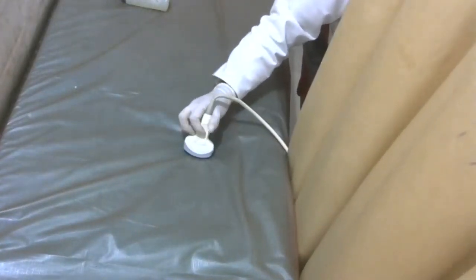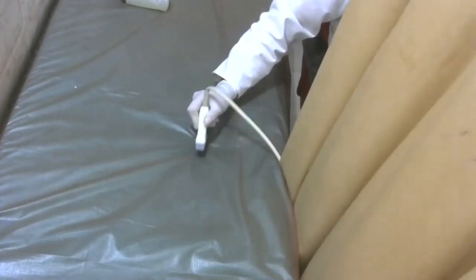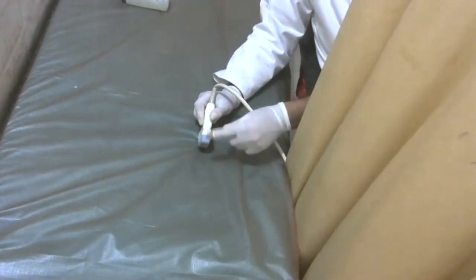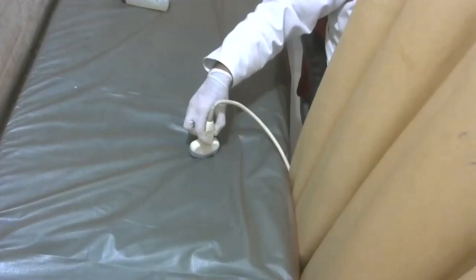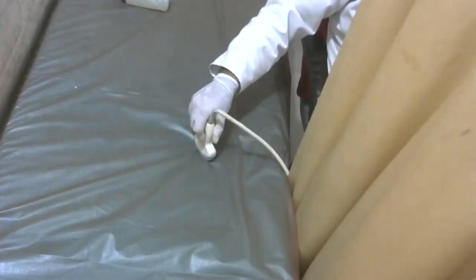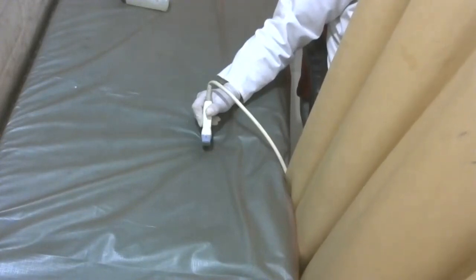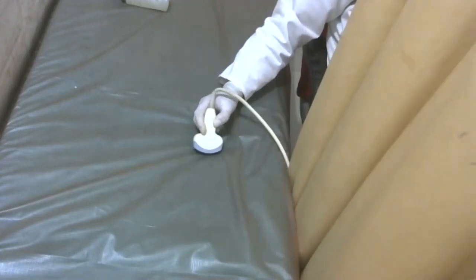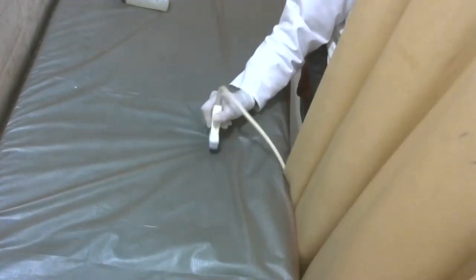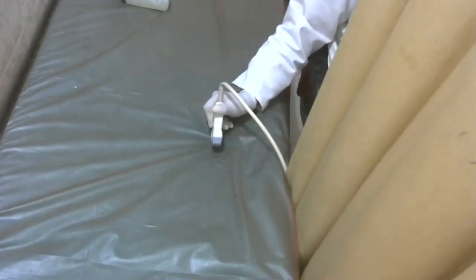Done? Now, when I am taking a longitudinal section, what do I have to do? I have to rotate the probe. The point is whether this indicator will go towards the head of the patient or towards the toe of the patient. Head of the patient, sir. Very good. Now this indicator will go towards the head of the patient. Clear? So this is how we take the transverse and longitudinal sections, and this is the rotation of the probe from transverse to longitudinal section.